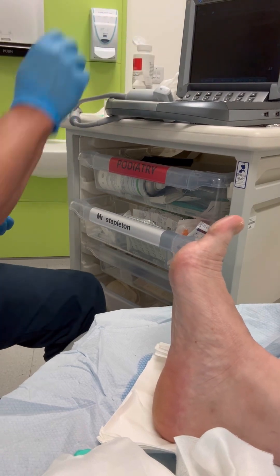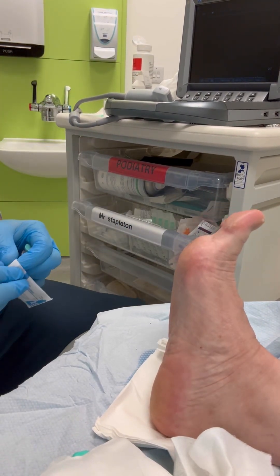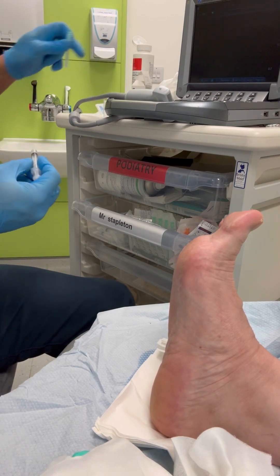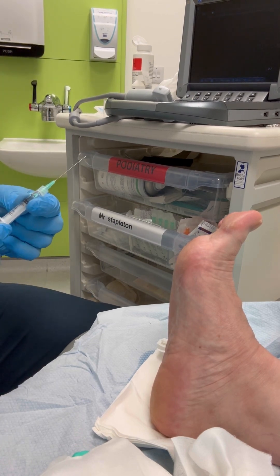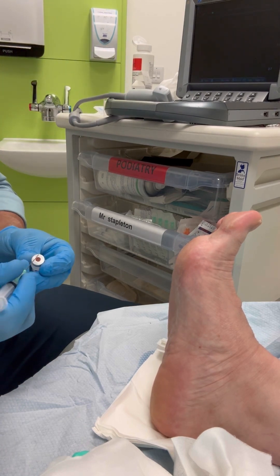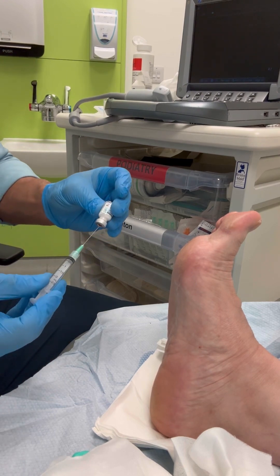I perform the injection in two parts. The first is with a local anaesthesia injection. For this I'm using 2% lidocaine, which tends to be very fast acting. This numbs approximately a small 50 pence piece size of the plantar aspect of the heel, and this means that the second injection is a lot more comfortable.